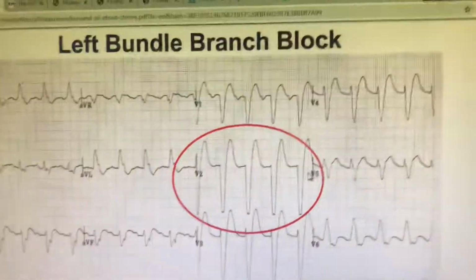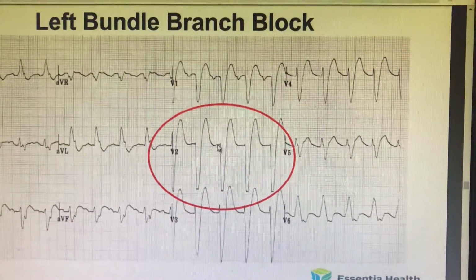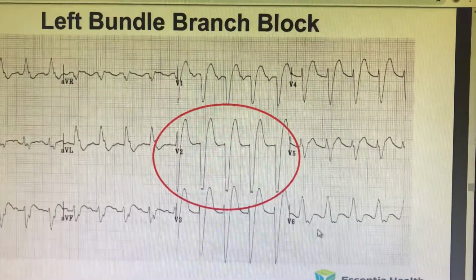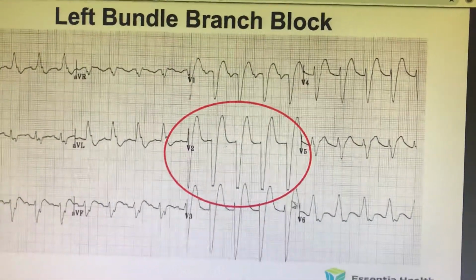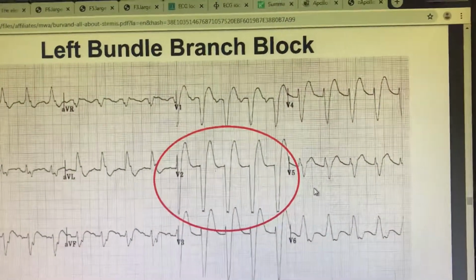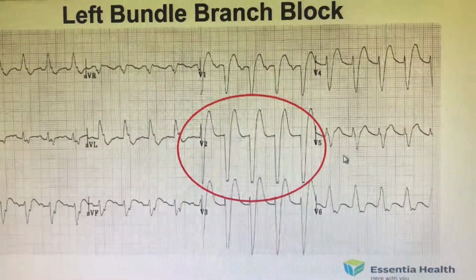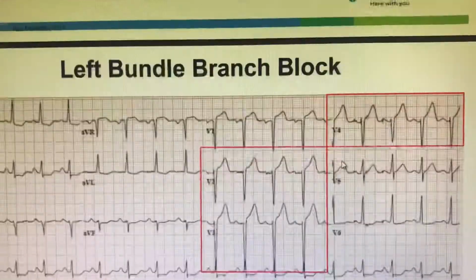So here is a classic example of LBBB, left bundle branch block. The ST elevation appears to be more than 5 millimeter but is not sensitive. Even this one is showing about 2 millimeter, but there are no leads in which concordant elevation of ST elevation is there. So it's not that accurate for any MI. It's only the left bundle branch block. Other than that, nothing else can be depicted from this.